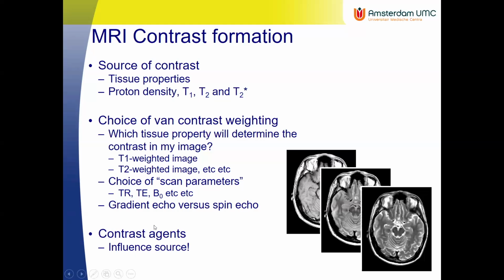And then there's a last thing I would like to mention here. I'm also going to explain how contrast agents work with MRI, because again, that's a bit different from CT.